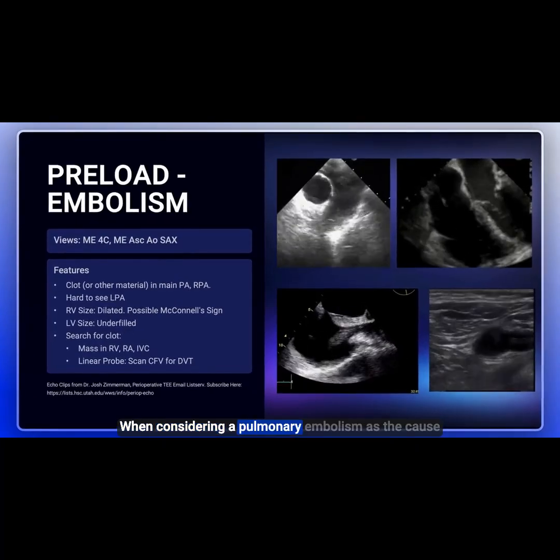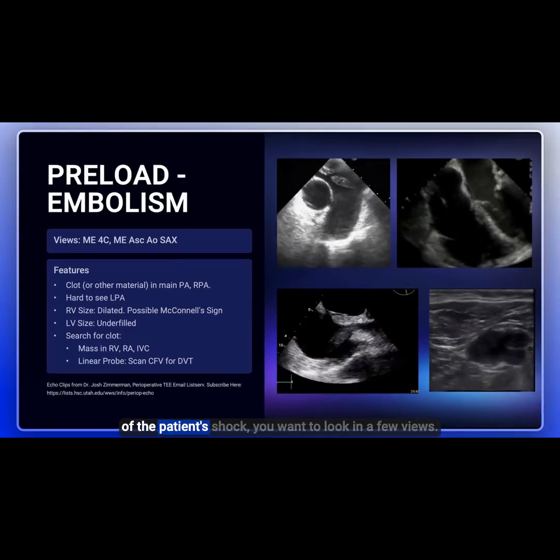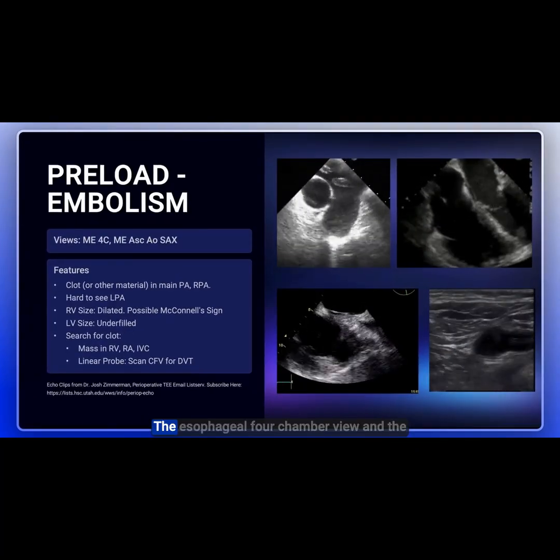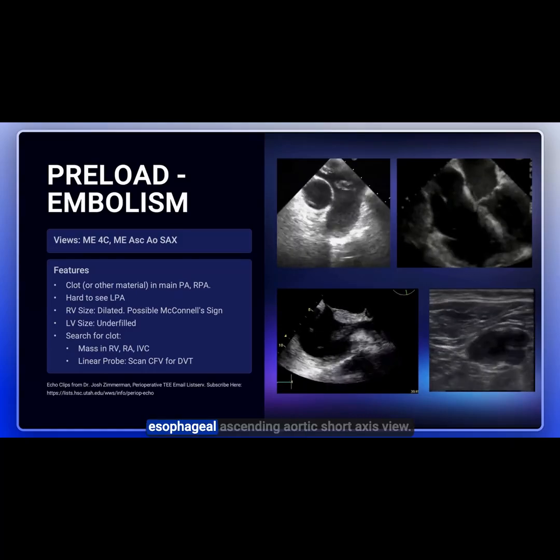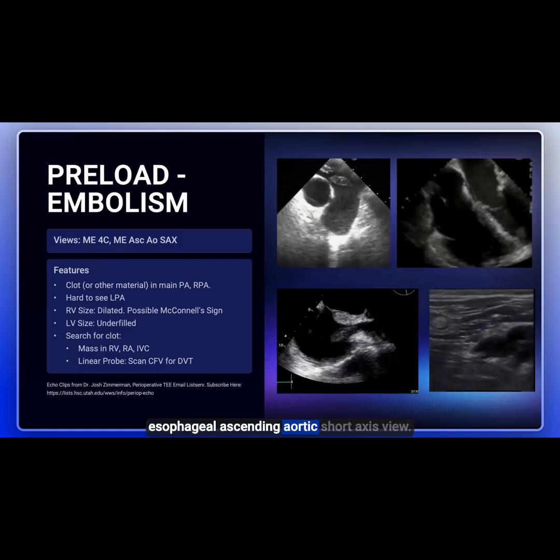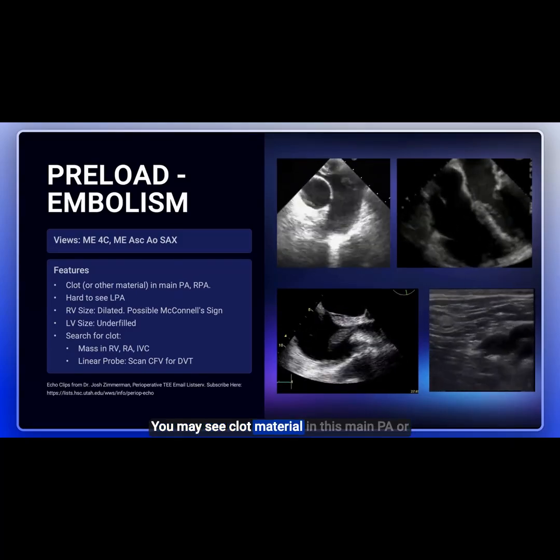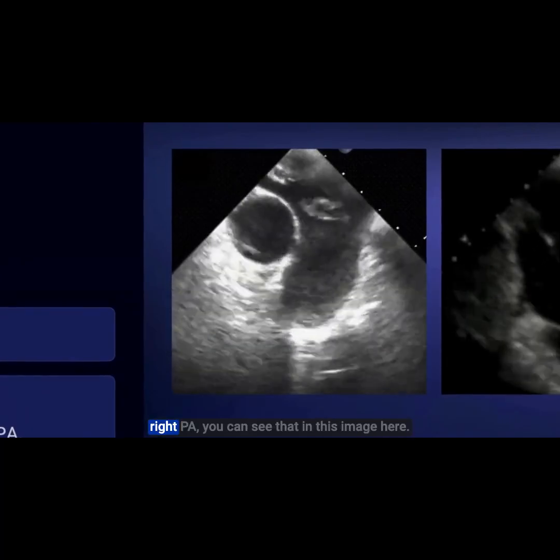When considering a pulmonary embolism as the cause of the patient's shock, you want to look at a few views: the midesophageal four-chamber view and the midesophageal ascending aortic short-axis view. You may see clot or material in the main PA or right PA.